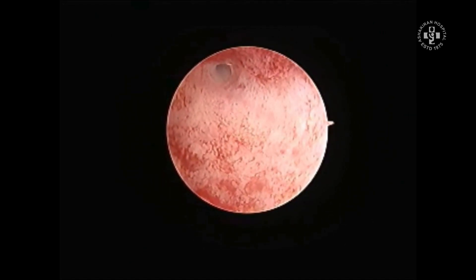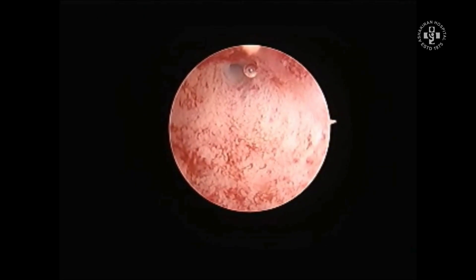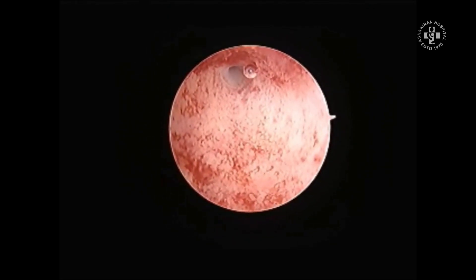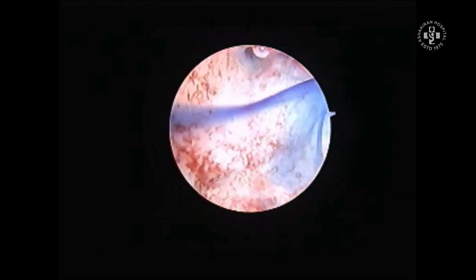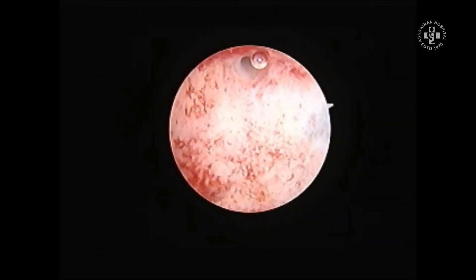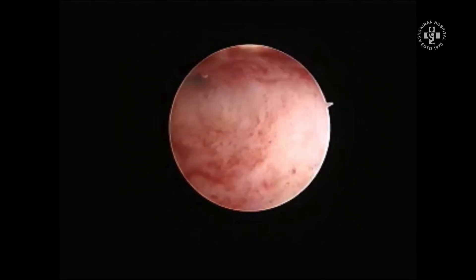Now you can inject methylene blue also. You can see the methylene blue is sucked up into the ostia and into the peritoneal cavity. This is a better tool because you need not do an HSG if you are just doing a hysteroscopy. You can tell the patient that the tubes are patent, because this is a dye test where methylene blue is injected and you can see it beautifully going into the ostia.